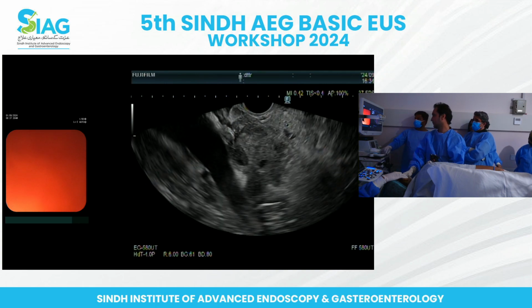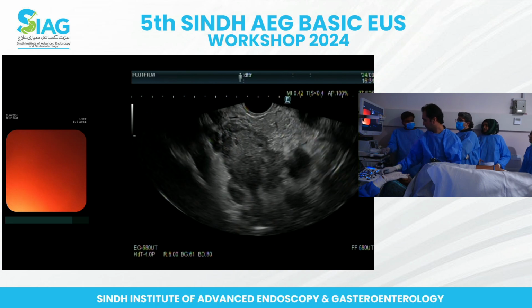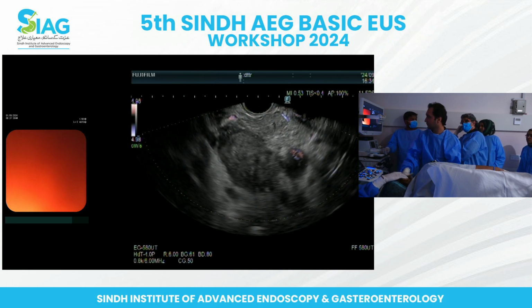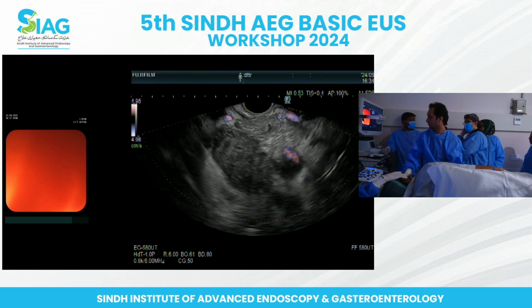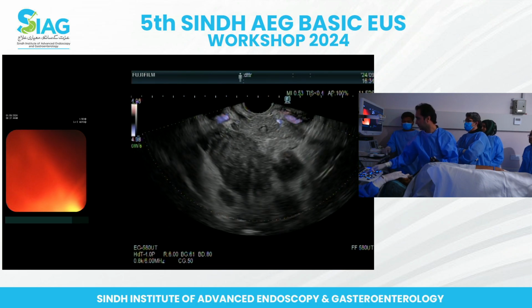There's no biliary obstruction here, Farooq. The bile duct is dilated, but it's not massively. It's about 9, and certainly not... She's not jaundiced either. Okay, 0.4? She's a bilirubin of 0.4? Bilirubin of 0.4, I'm told. Thank you.